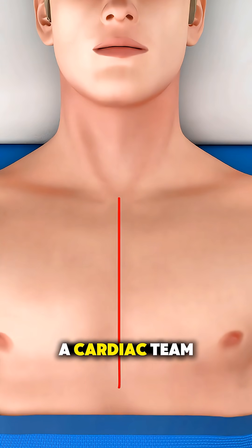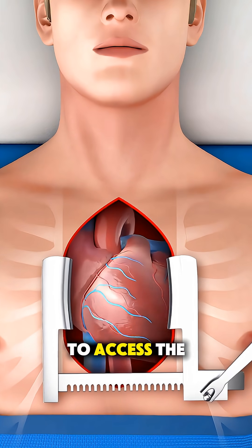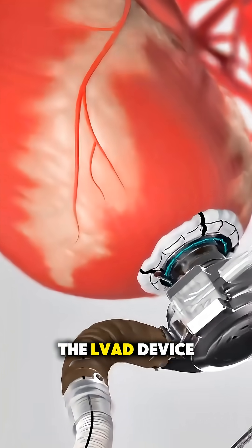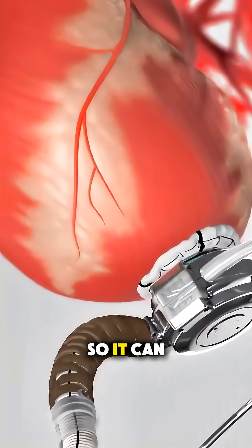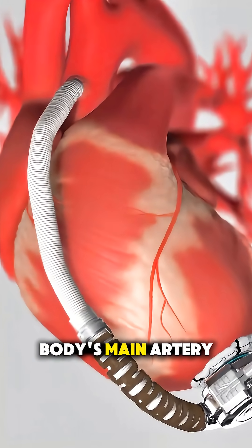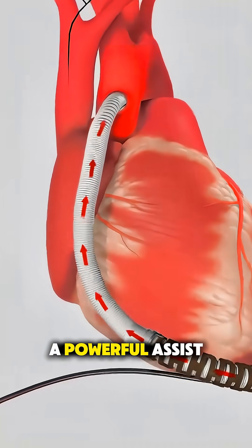During surgery, a cardiac team opens the chest to access the heart and prepares it for support. The LVAD device is positioned so it can draw blood from the heart's main pumping chamber and send that blood into the body's main artery, giving the heart a powerful assist.